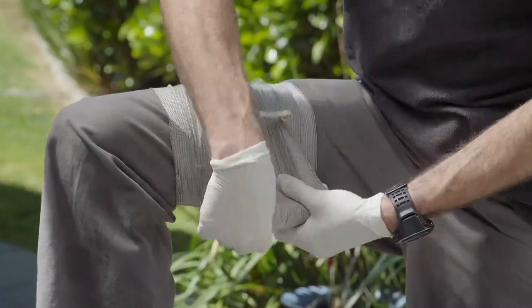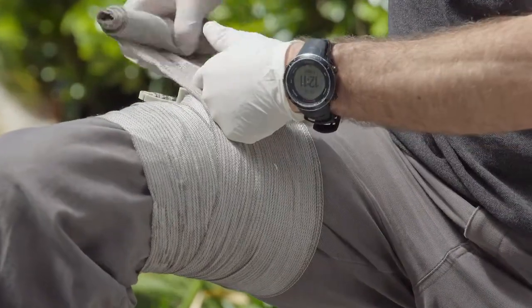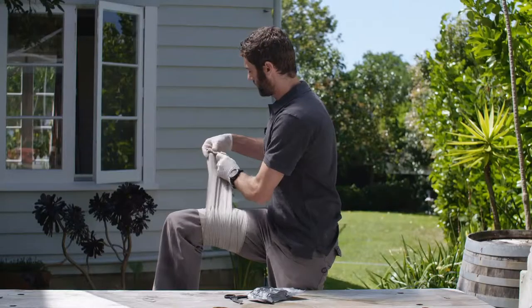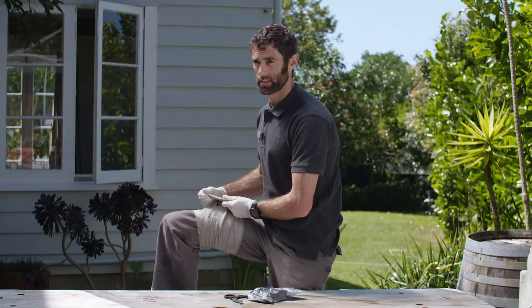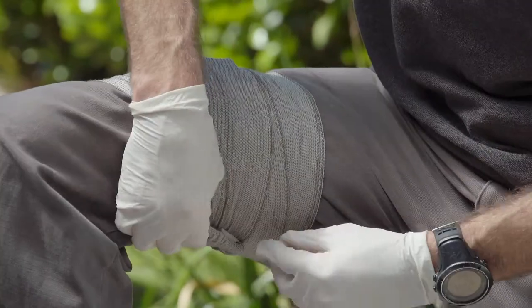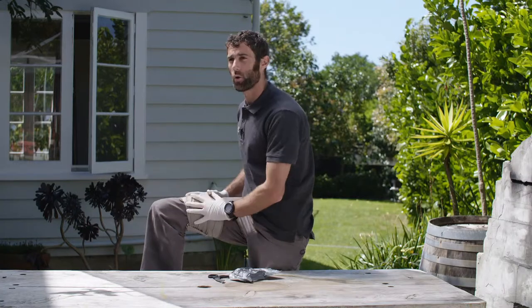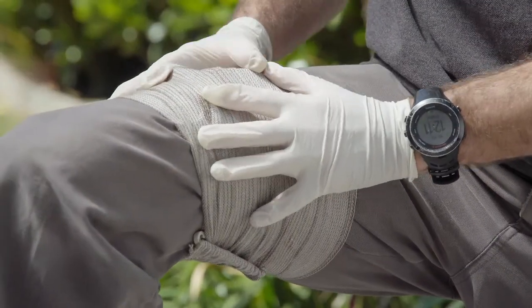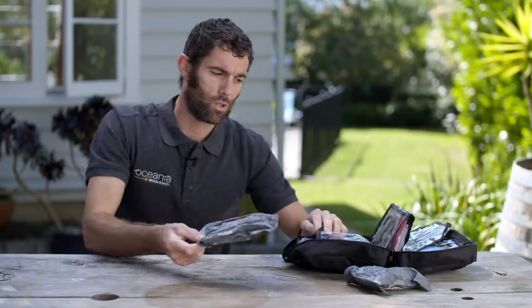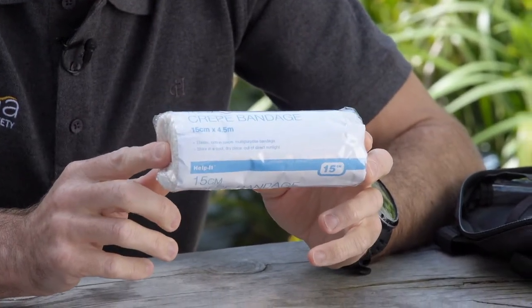We go through the torsion bar, crank it nice and tight, and continue to wrap it up tightly and fully. As you get to the end, there's a plastic bar here that will allow you to clip it onto the bandage anywhere you can find. Keep a good eye on it to make sure it's not re-bleeding through the bandage — if it is, you need to try again. We have two of those, plus your standard 15cm crepe bandage as you get in a standard first aid kit.